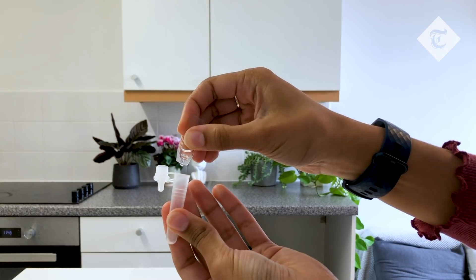Next we'll prep the extraction fluid. This is the fluid that comes with the test and it goes into the dropper.